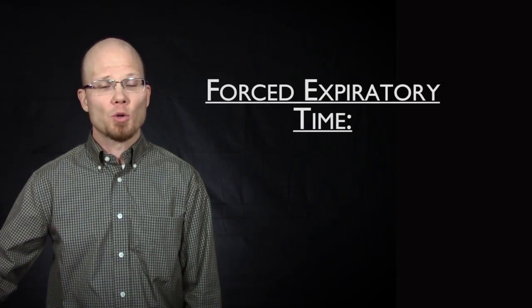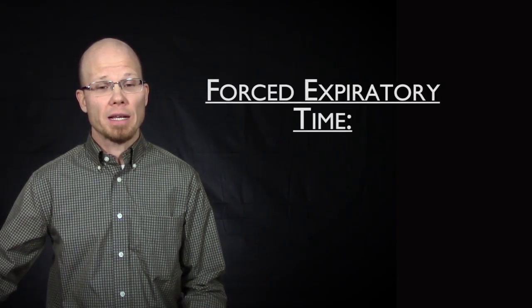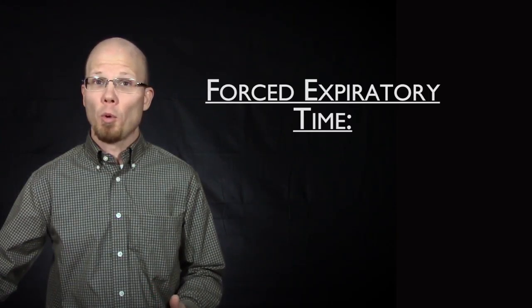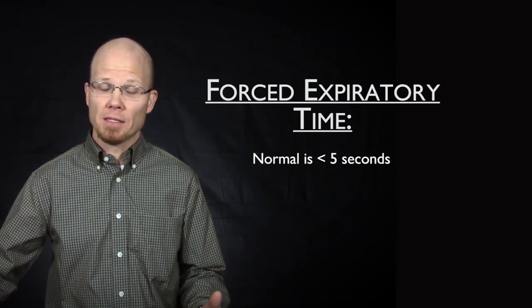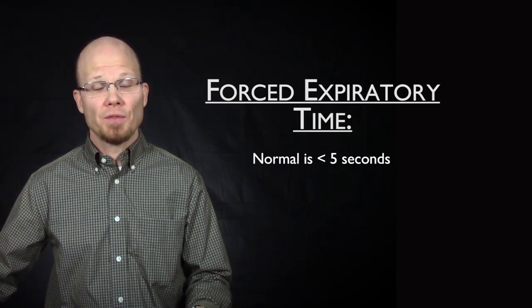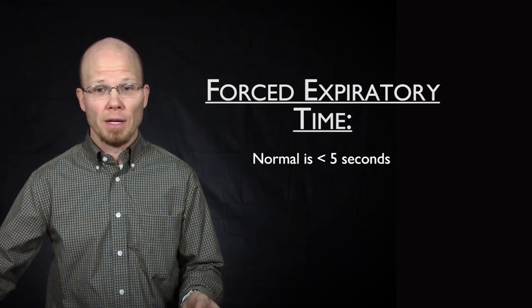The forced expiratory time is the number of seconds required to exhale the FVC. In a normal patient, that's less than 5 seconds, but in severely obstructed patients, they may take up to 15 seconds to exhale their full FVC.